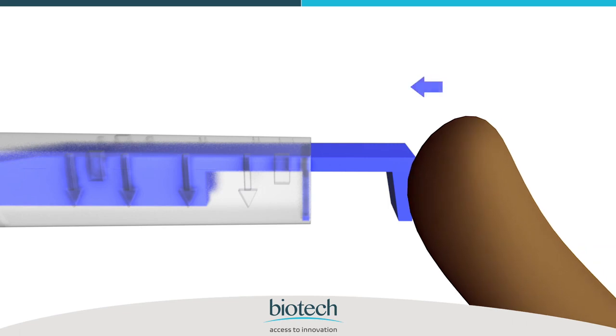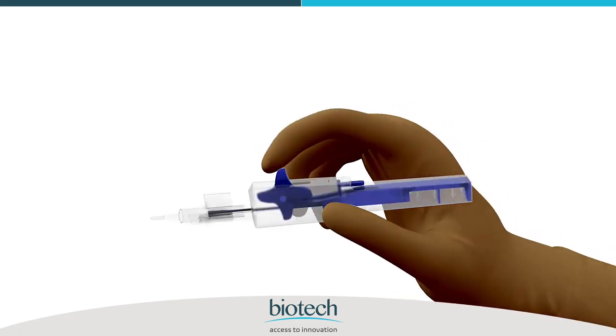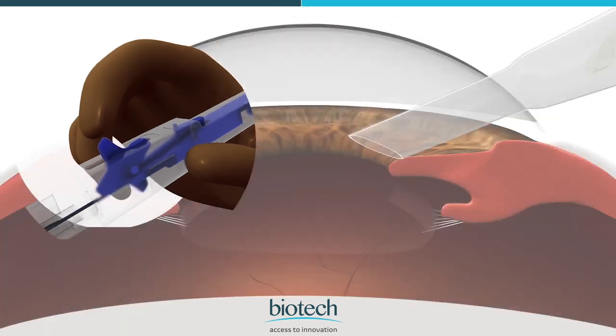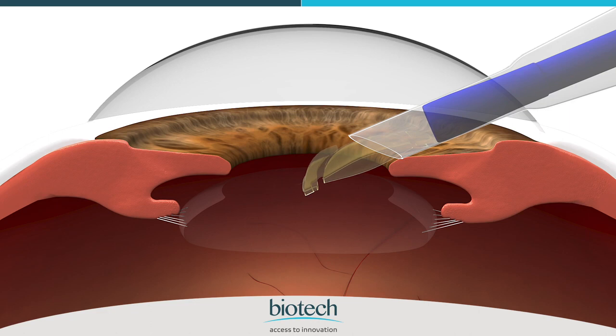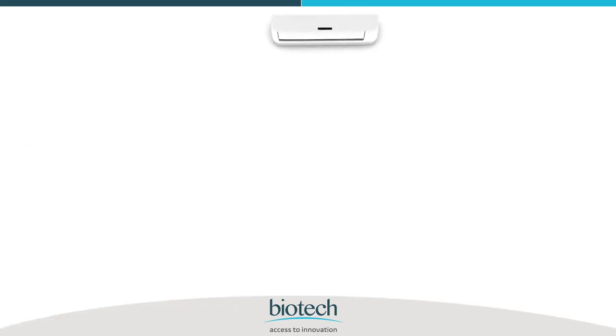Push the blue injector plunger forward until the rear push plate is flush against the injector housing or until the wheel of the injector moves. Hold the delivery system with a pen grip as shown, and keep your index finger on the drive wheel. Insert the cartridge tip into the eye with a bevel down position. Using your index finger, pull and rotate the drive wheel back slowly in order to push the lens forward until it is delivered in the eye. This pre-loaded delivery system provides freedom to use the second hand to stabilize the eye while injecting the IOL, giving complete control on delivery of the IOL.